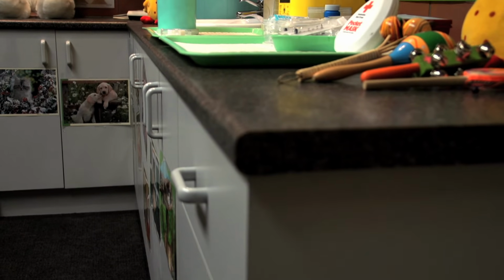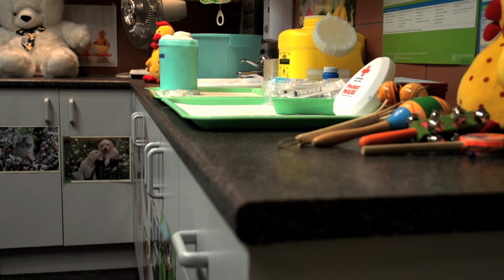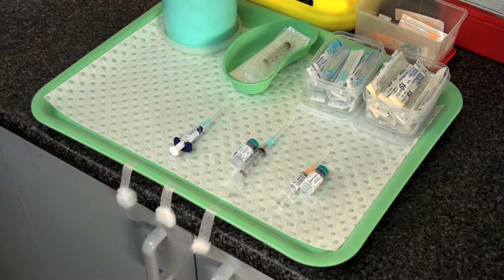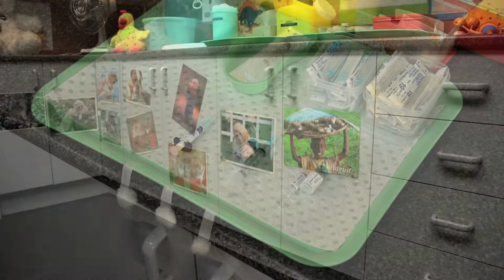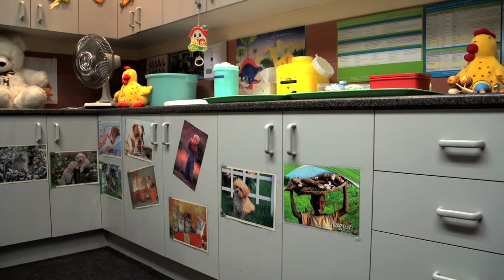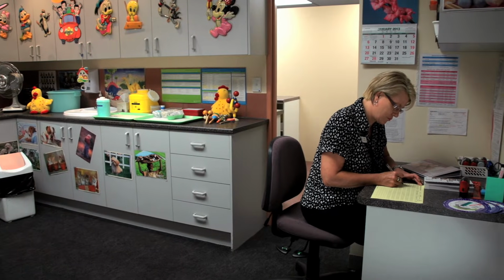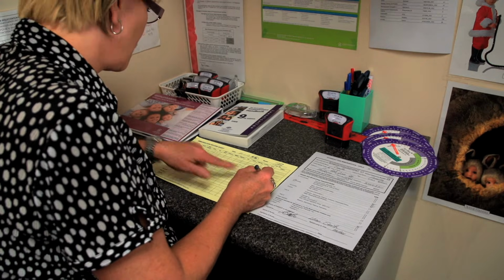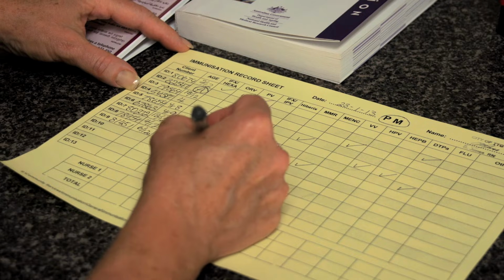Set up a tray with a disposable liner, arranging all equipment that will be needed for the vaccination clinic. Make sure the clinic tray and yellow Sharps disposable container are accessible but out of reach of young children. Using a running sheet in the clinic helps with the final count at the completion of the clinic, allowing for a quick follow-up of discrepancies in the final count.